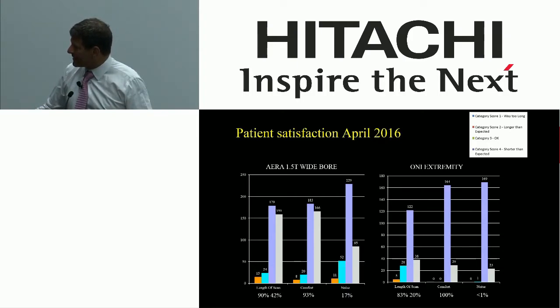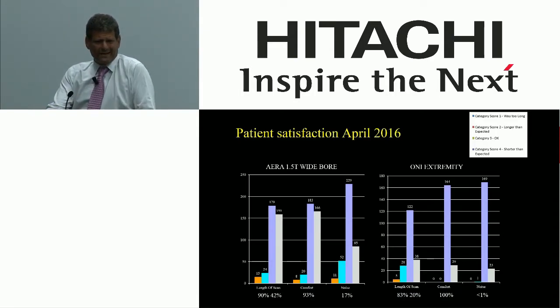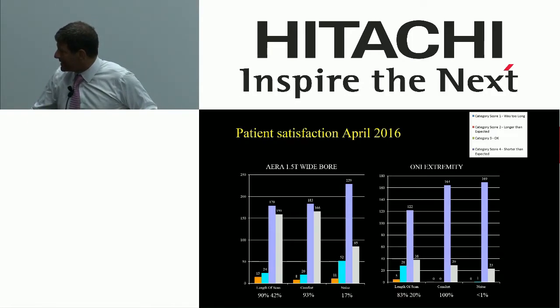Good news is we don't have a lot of worse than expected on any of these scanners, and we're doing pretty well here in terms of noise and even comfort. Notice that we get more positives on comfort, more positives on noise, and more positives on length of scan on the closed bore unit than I get sitting in a thing like this. Why is that? Scans are shorter, okay? 90% of the people said the scans were either as expected or better.